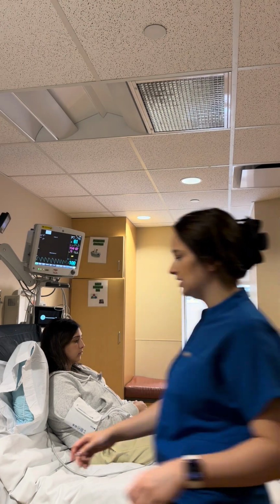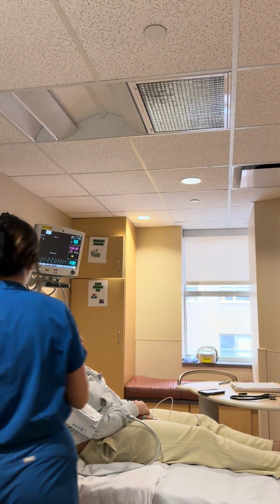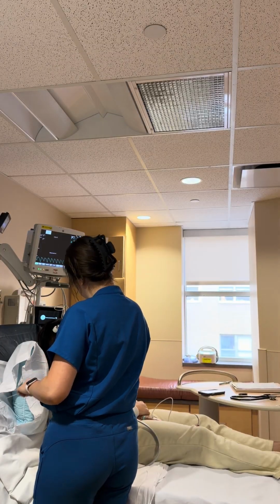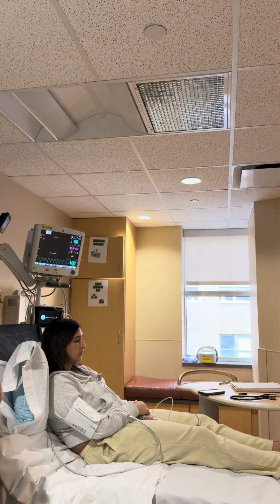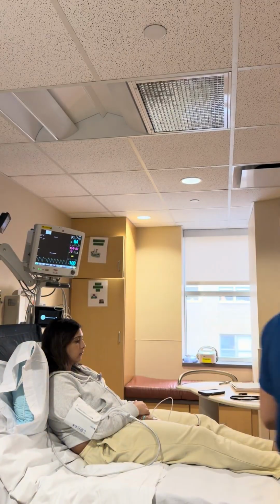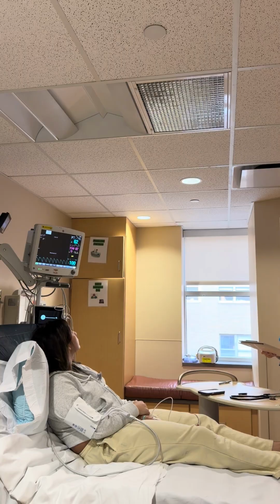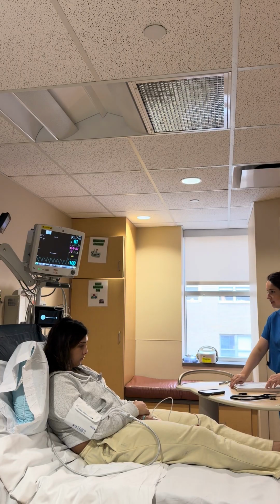We'll first get a temporal temperature. Patient's temporal temperature is 36.7 degrees Celsius. Heart rate is approximately 62 beats per minute. Blood pressure is 114/67.